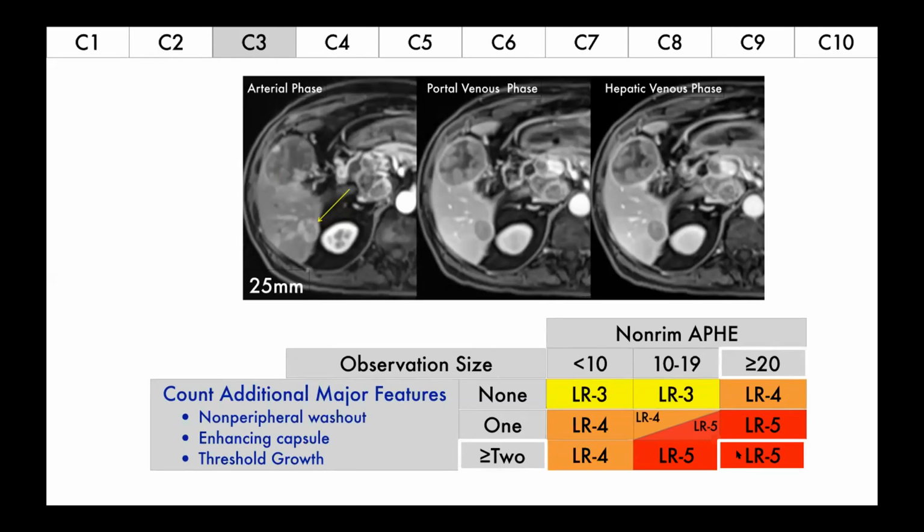Now I've got a couple of pointers to tell you. As per the LI-RADS algorithm, the washout must happen in these 2 phases, pretty early on in the temporal enhancement characteristics of the tumor itself. But what we see in our setting, especially in the Indian subcontinent, is that the washout may not happen so early. It may happen probably at 3 minutes, 4 minutes, or even 5 minutes.